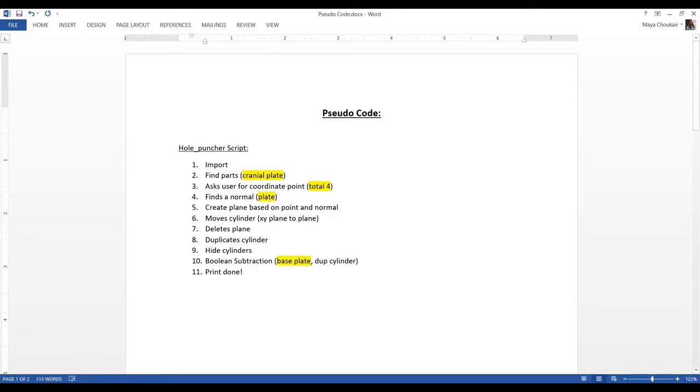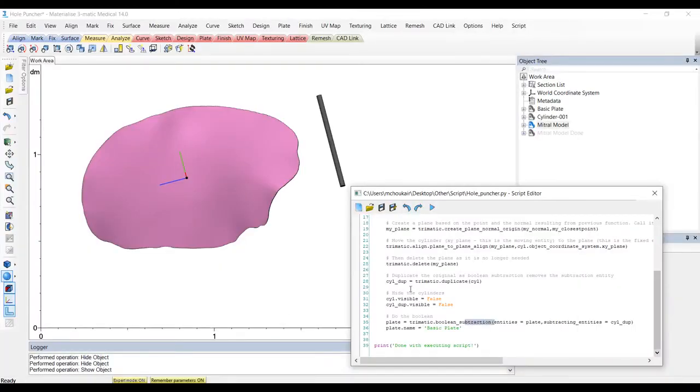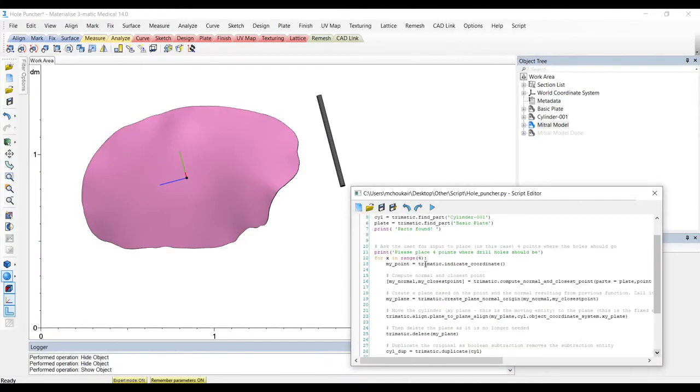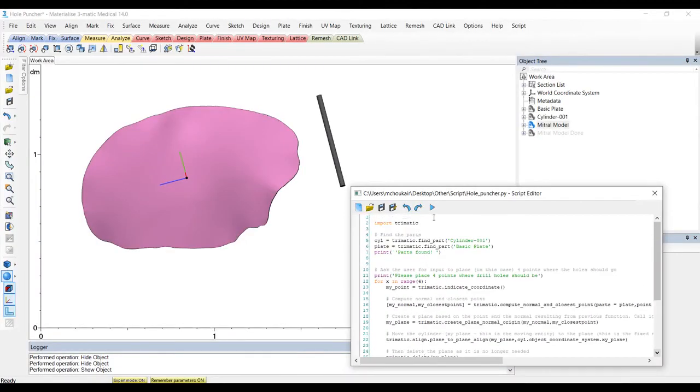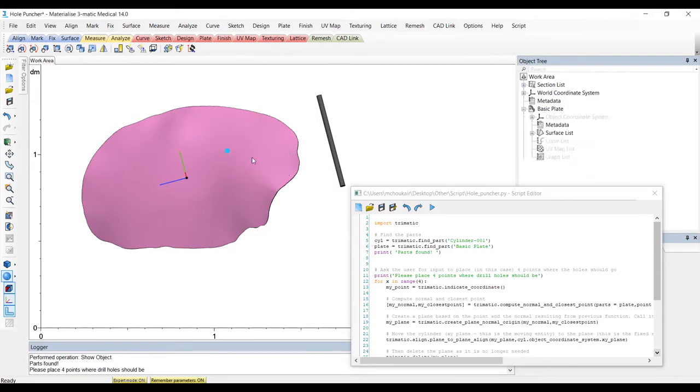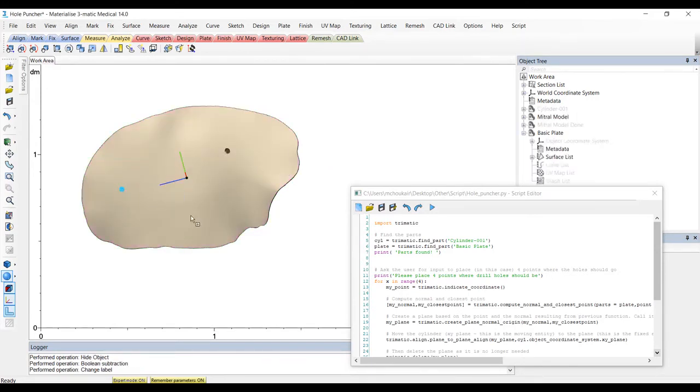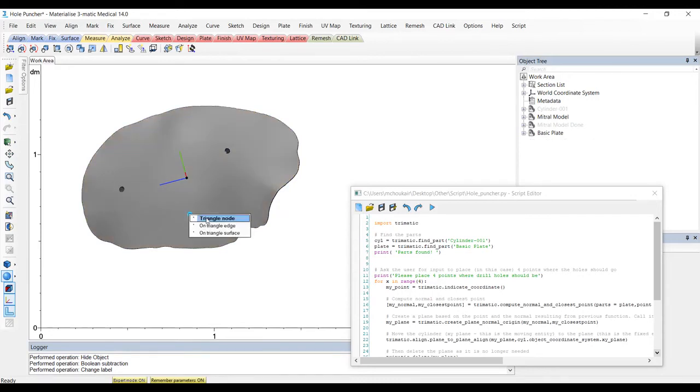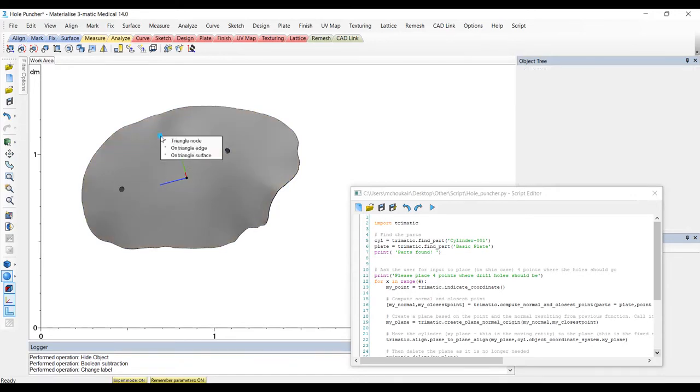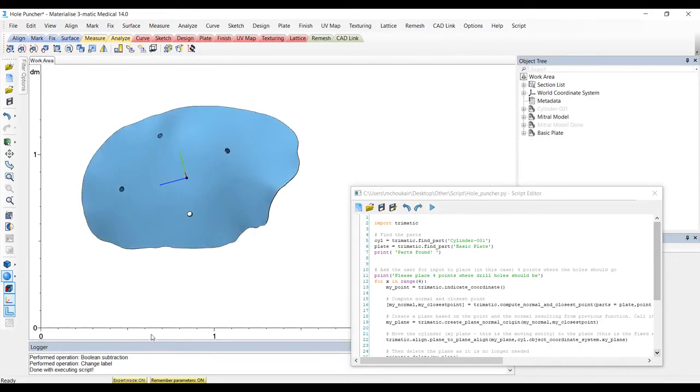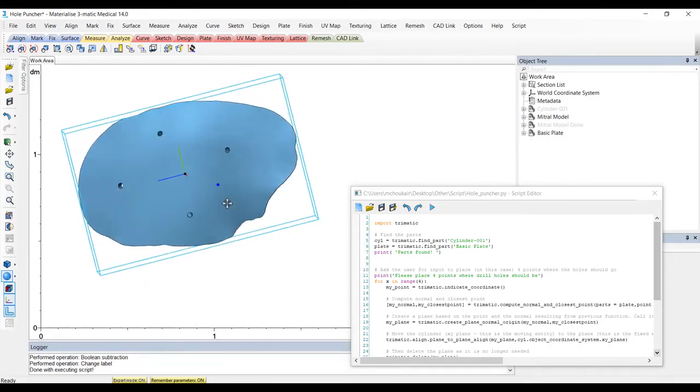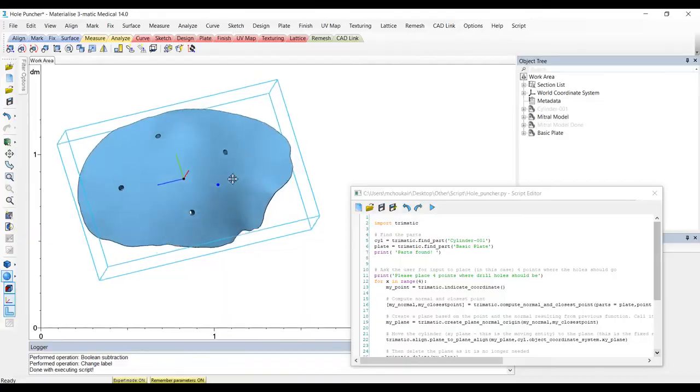So now let's head back over and actually play this script and make sure that it's doing exactly what we expect. And you want to keep your eye here on that logger. So it's asking us to place those four points. So I'll place one here, one here. And once I'm all set, you will see it says done executing script.